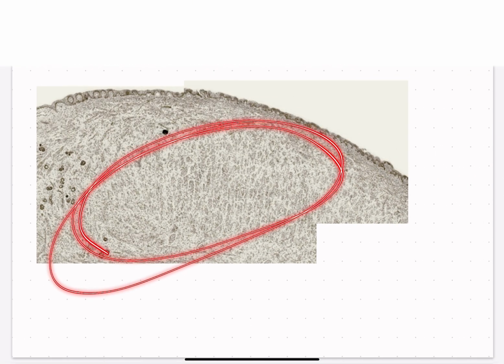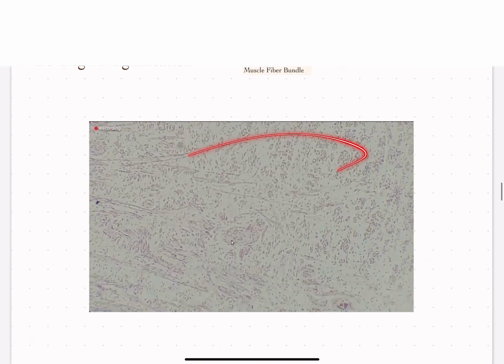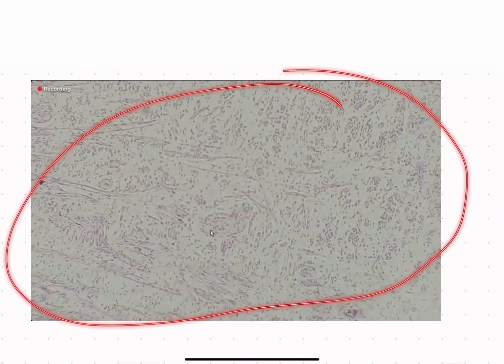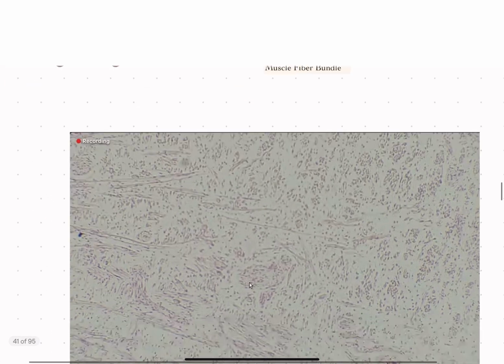This is all skeletal striated muscle fiber, but we are zooming into the skeletal striated muscle fiber, and see how it looks like dots everywhere. That's because the tongue is such an intricate muscle. It has all of these networks of immature striated skeletal muscle fibers. So these are not immature, it could be mature. In this colloquium, it doesn't matter. You can write in mature, you can write in immature. I would not use any of the adjectives. I would just write in striated skeletal muscle fibers.